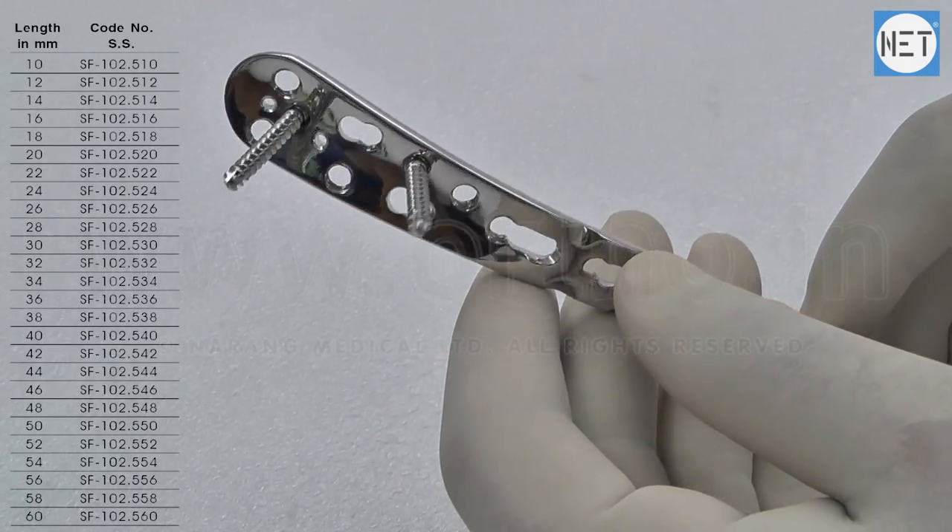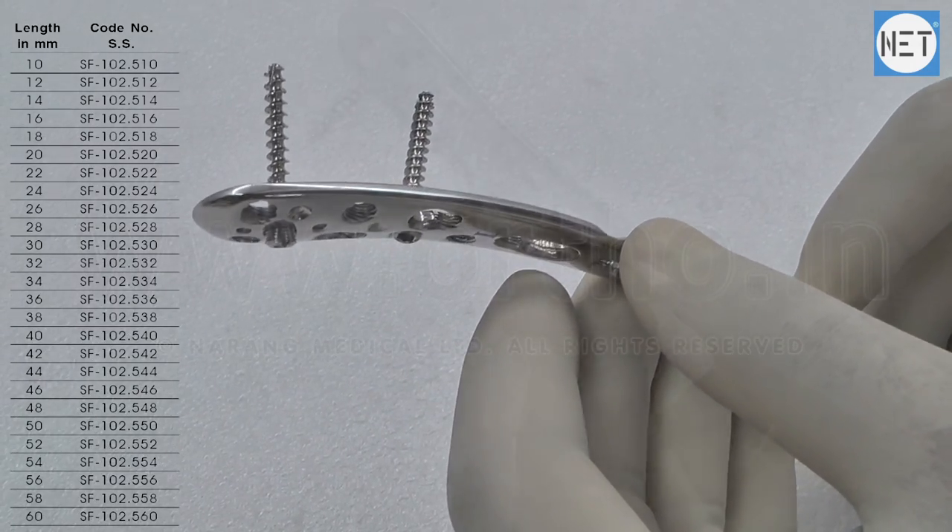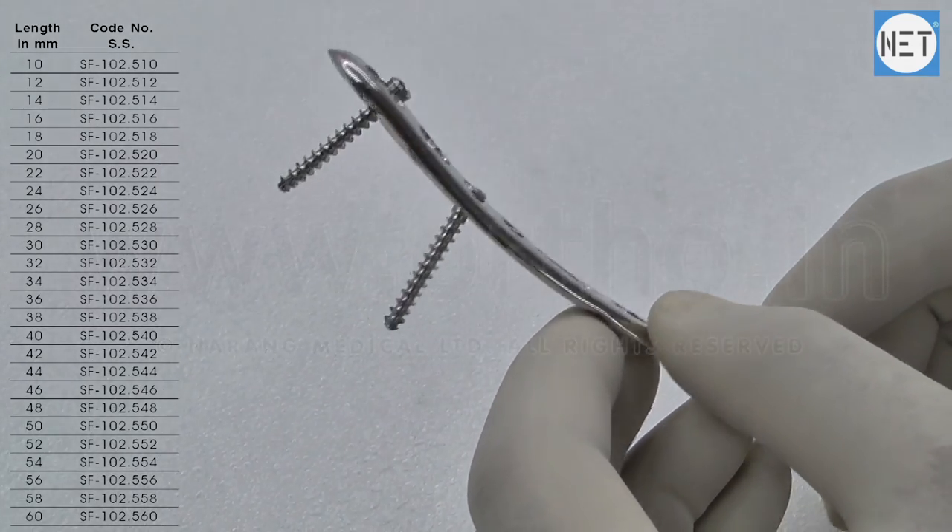These screws are available in lengths varying from 10 to 60mm and are available in stainless steel and titanium.